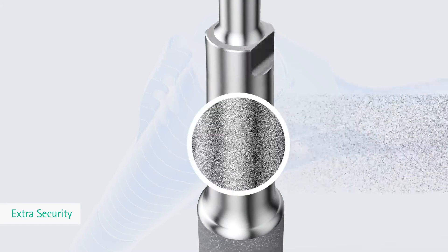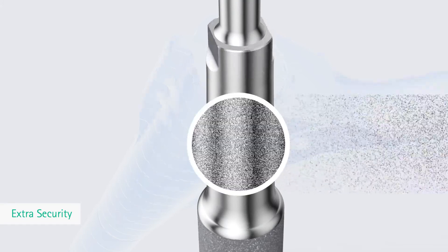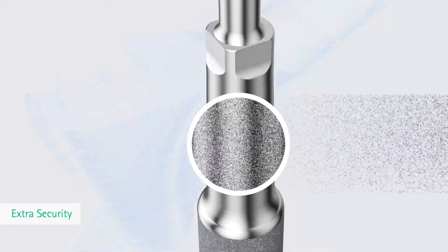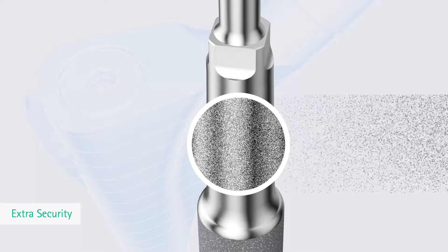Tapered junction fracture remains a concern for many revision surgeons and specialists. In order to provide optimal fatigue strength, every component went through an elaborated shot peening process.